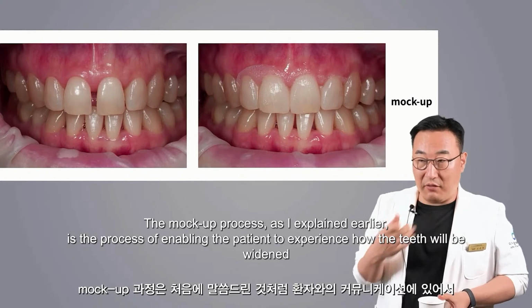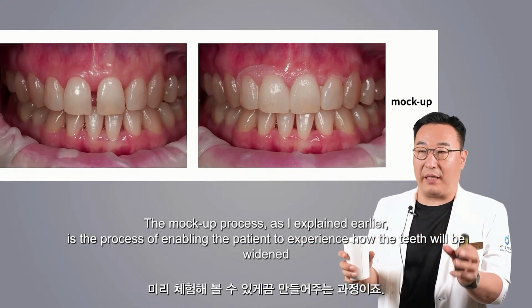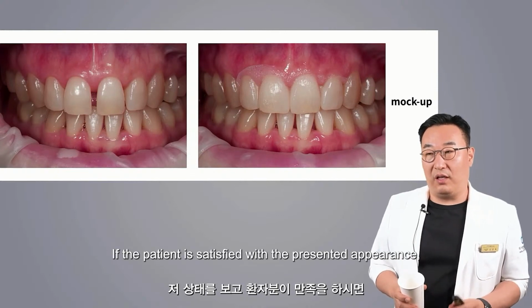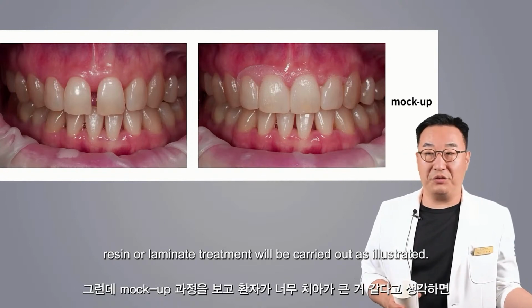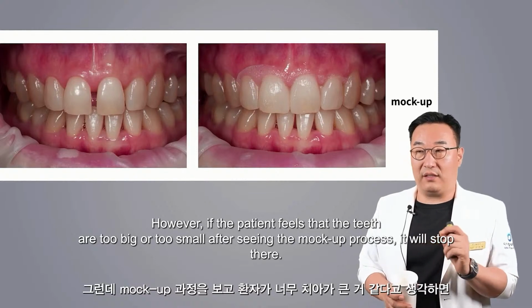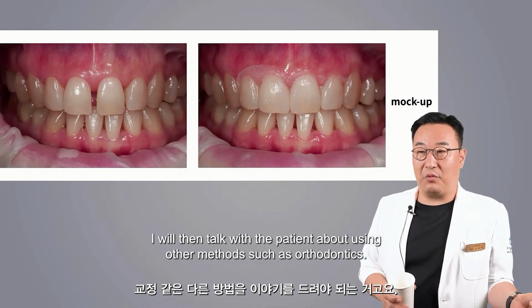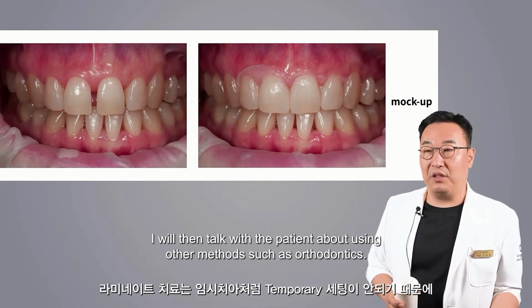The mock-up process, as I explained earlier, is the process of enabling the patient to experience how the teeth will be widened and how their shape will change by communicating with them. If the patient is satisfied with the presented appearance, resin or laminate treatment will be carried out as illustrated. However, if the patient feels that the teeth are too big or too small after seeing the mock-up process, it will stop there. I will then talk with the patient about using other methods, such as orthodontics.